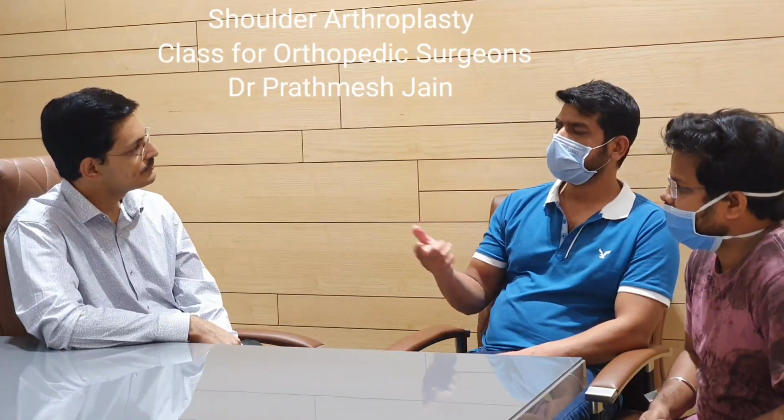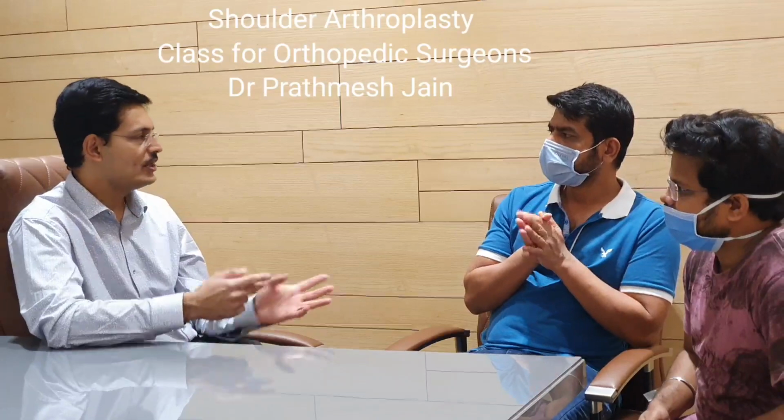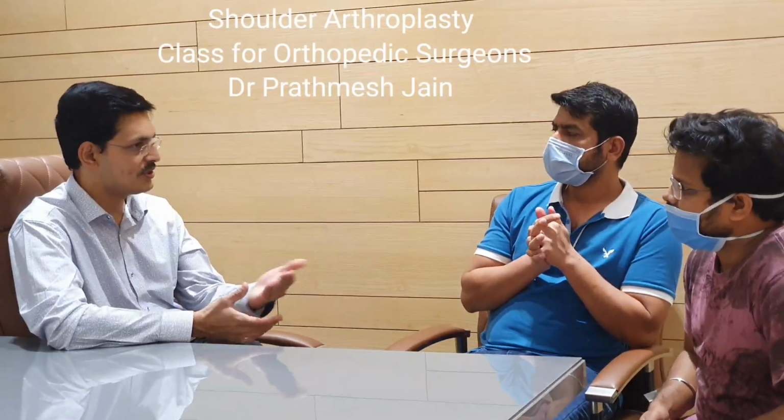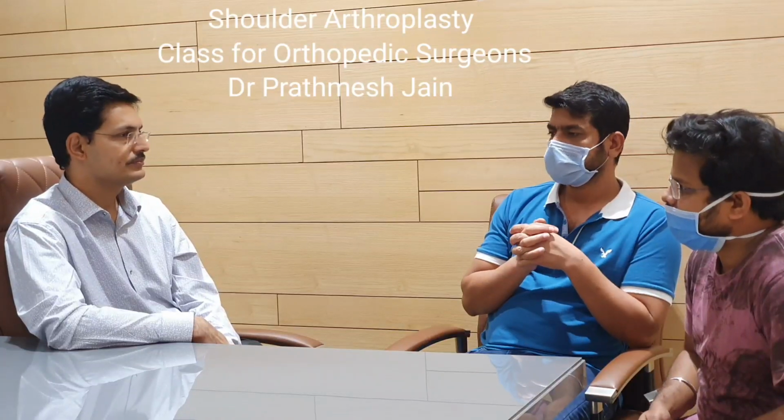And revision surgery can also be done after 10 to 15 years? Yes, we can do a revision surgery. These revision prostheses are also available for these joints.